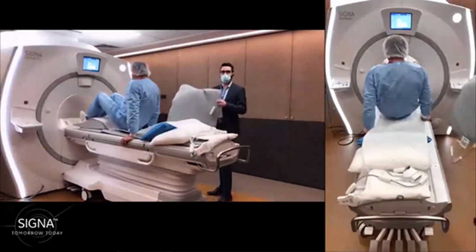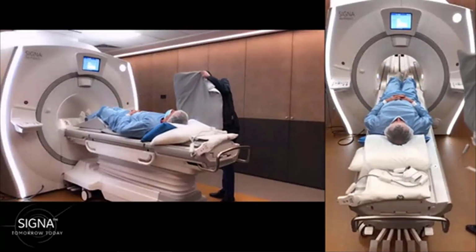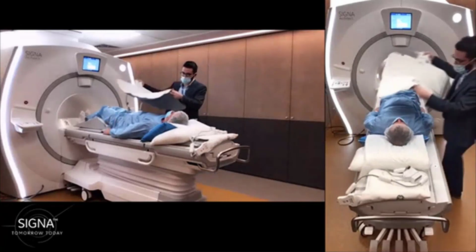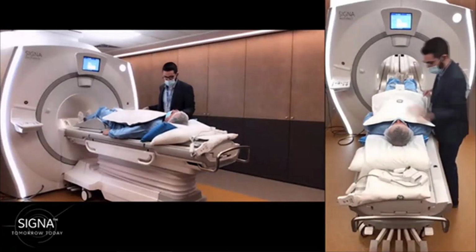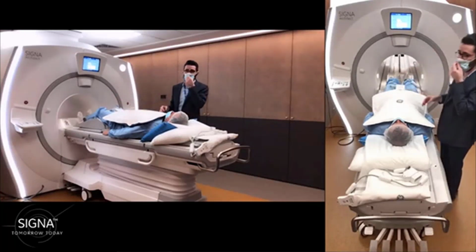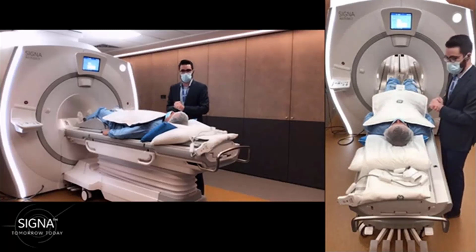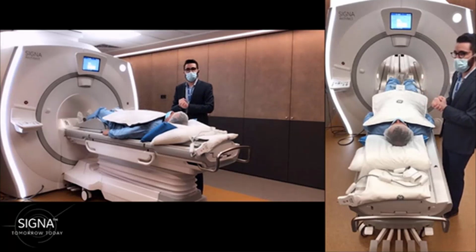So you can see I will really use this air coil as a blanket. It will be really easy for me to position and really easy for my volunteer to handle. You can see here, I'm really adapting the coil to the morphology of the patient. Starting from that, we are ready to scan.